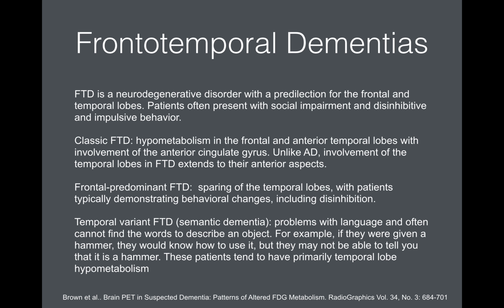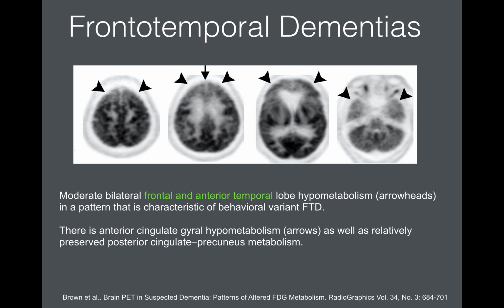Frontotemporal dementia, again, classic appearance where there is a decreased metabolism in the frontal and temporal lobes, making it pretty simple to diagnose. So again, frontotemporal dementia is decreased metabolism in frontal and anterior temporal lobes, as evidenced on these images.